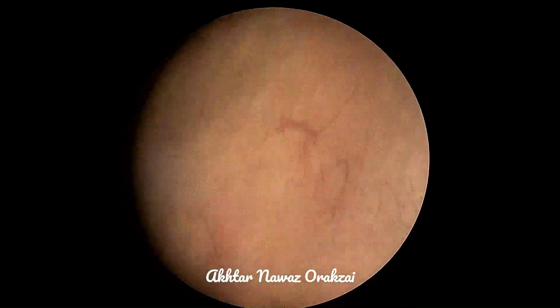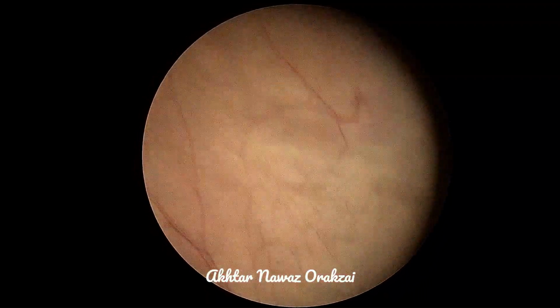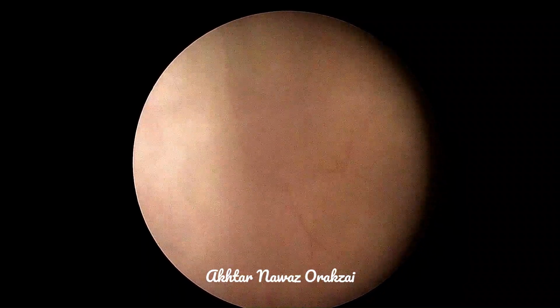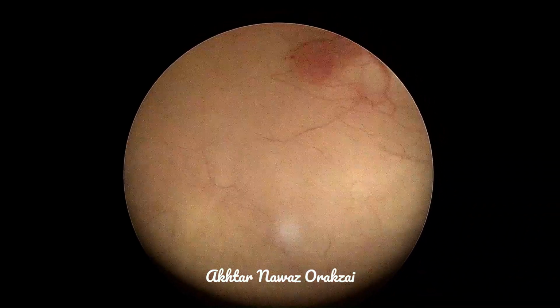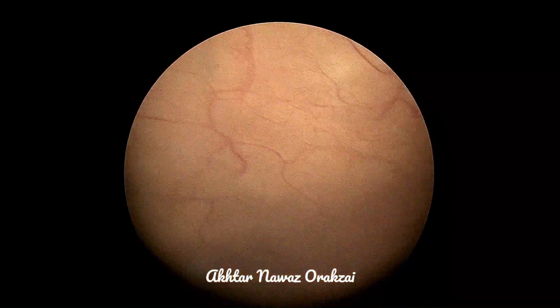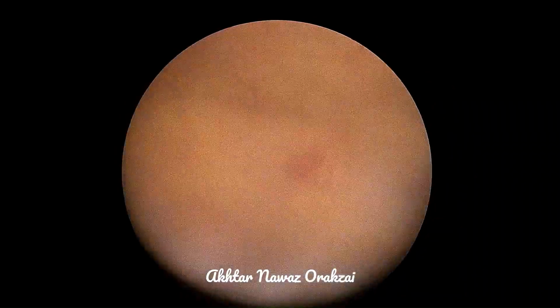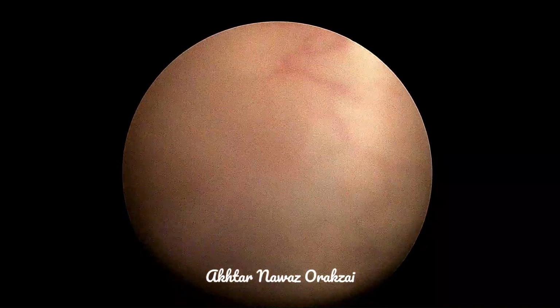The right lateral wall, the posterior wall, the left lateral wall, and the dome, and then the anterior wall. All is inspected for presence of any tumor. We can see the suspicious vessels all around. There is another small mass. You can press with the hand on the suprapubic area to see if there is any mass. Here you can see that there is another papillary growth on the anterior aspect, 12 o'clock at the bladder neck.